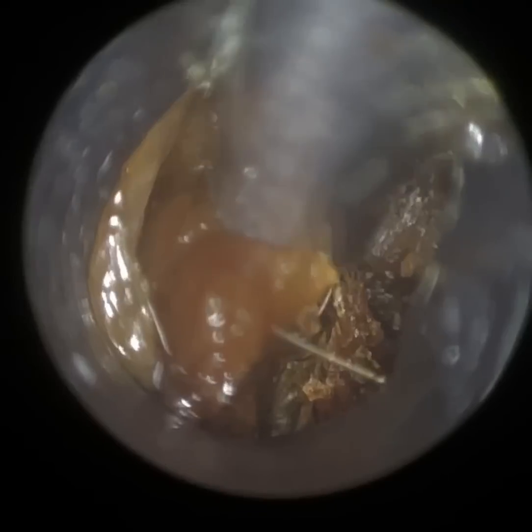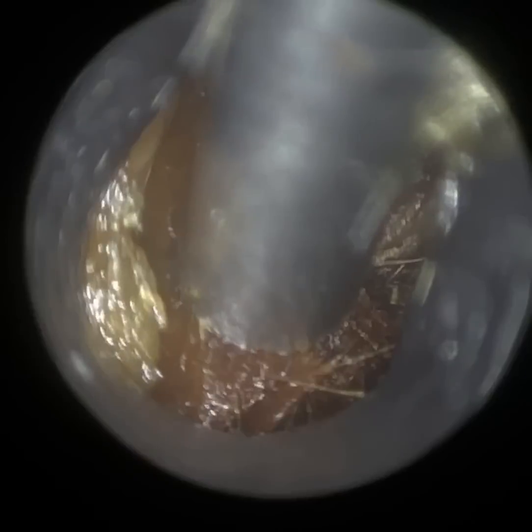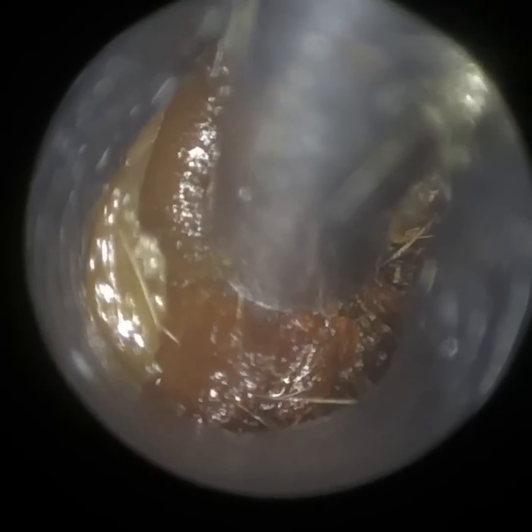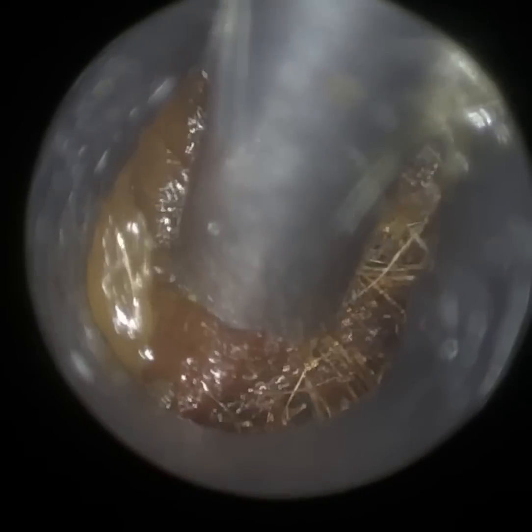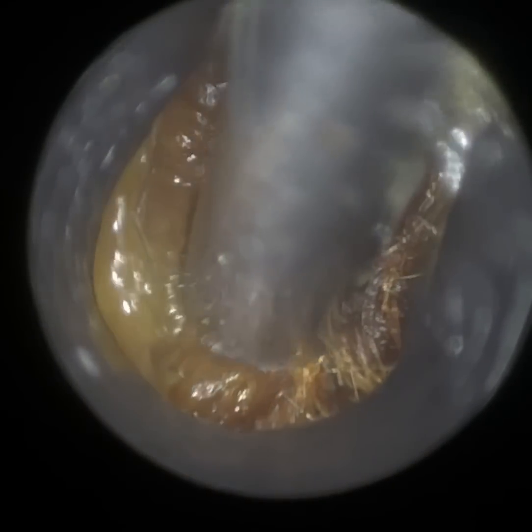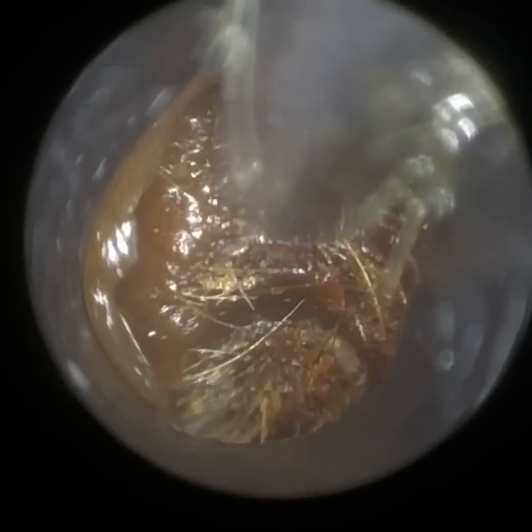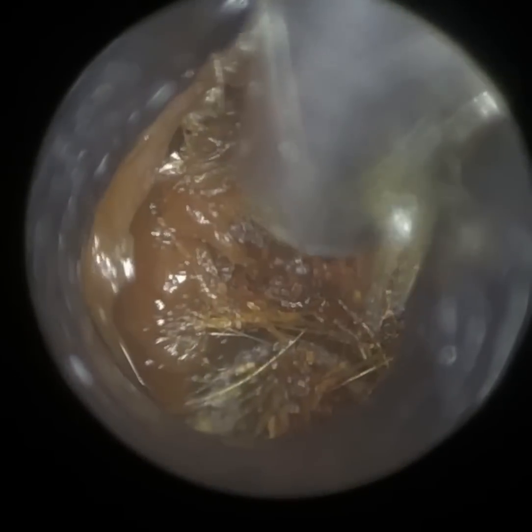For this particular patient, the use of the drops exacerbated their symptoms because the ear was already so blocked — it had absorbed the drops, which caused the wax to expand and create more of an occlusion. This created more of a blocked sensation, a bit more otalgia, more reduced hearing, and it also exacerbated their tinnitus.